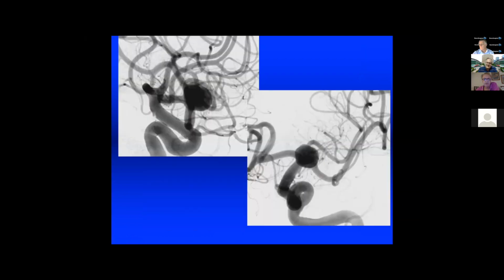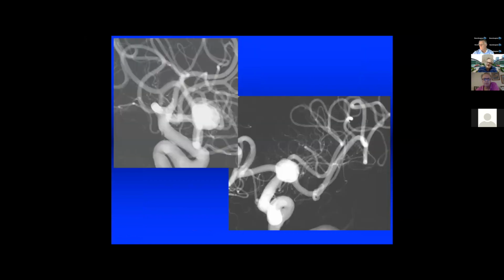Okay, this is the aneurysm. This is AP view and lateral view. This is the road mapping. And to start, I navigate inside the sac. This is a balloon remodeling. I put 1 balloon in this branch from this to here, a second balloon in the second branch.